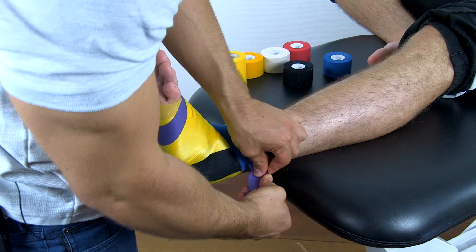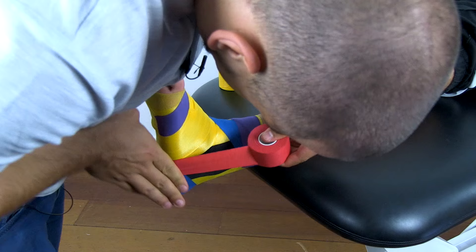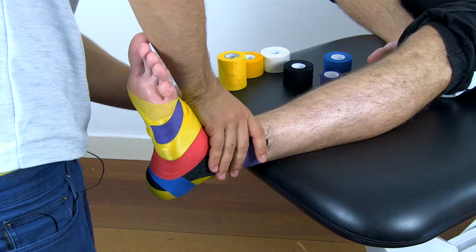After that, I'm going to add the anti-inversion strip. Start medially at the proximal anchor and move it under and around the foot and attach it medially again. You can repeat this step and overlay the tapes by two-thirds as previously mentioned.